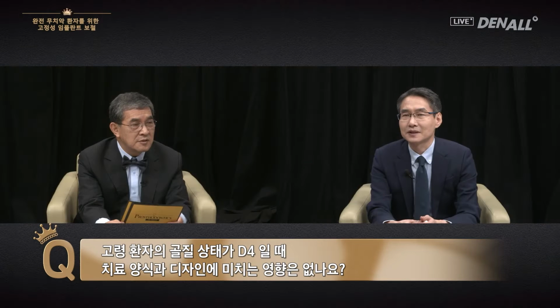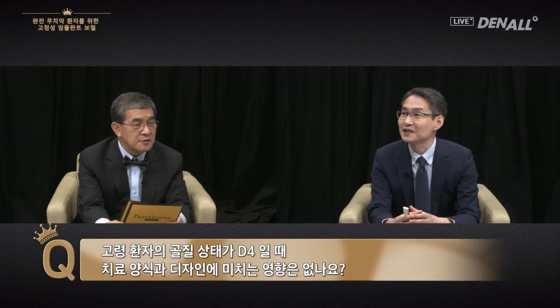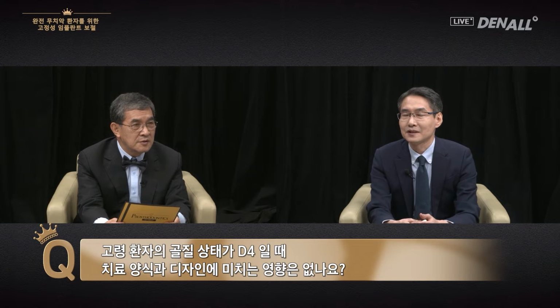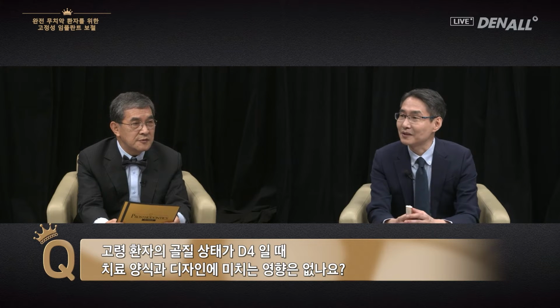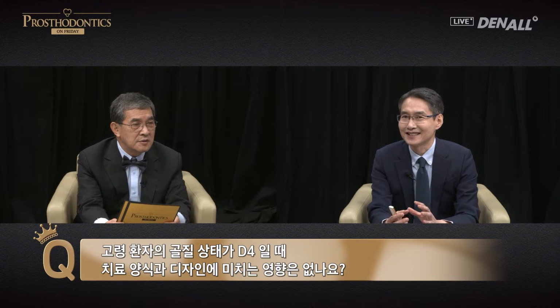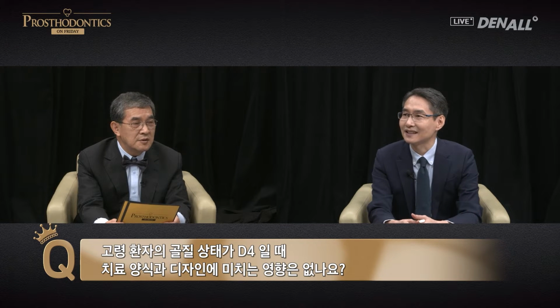We have to get good primary stability, such as undersized drilling, doing bone graft ahead. Different methods can be utilized to gain a certain level of primary stability. If we just could push past the initial stability dip, then after that, the bone quality and implant prognosis will not be significantly affected. We need to overcome that period where early failure occurs.